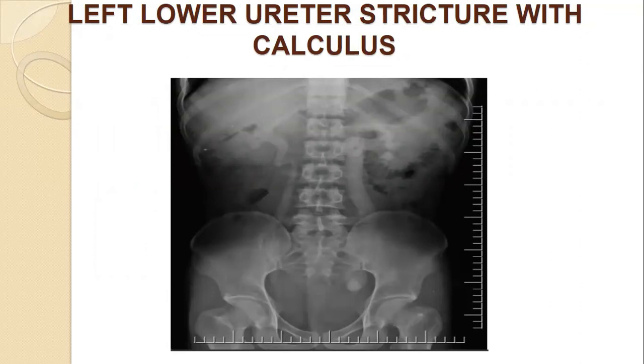Anyone can tell about this? Any reason? Dr. Zafar. Sir, I see a dilated portion of the left ureter more as compared to the right one. I think there is some sort of distal obstruction in the course of the left ureter, near its distal third junction, that is near the VUJ. So it's a distal ureteric stone, obstructed with a dilated system. Yes, a filling defect. So you have to compare this image with the scout film.